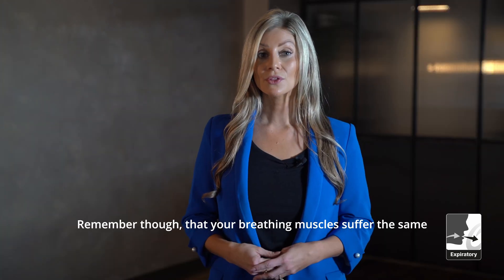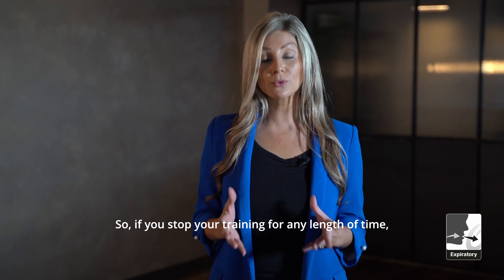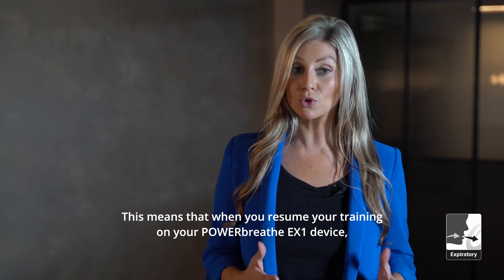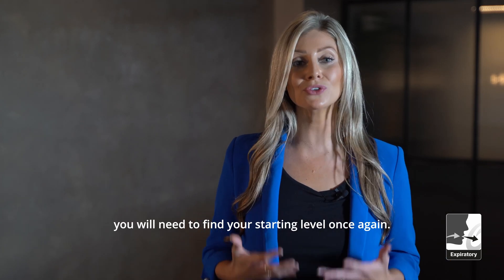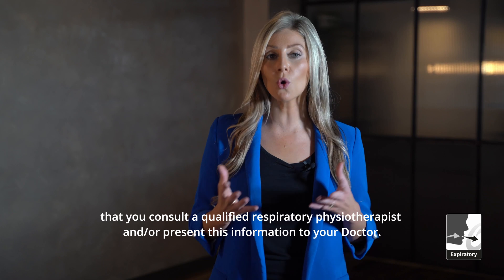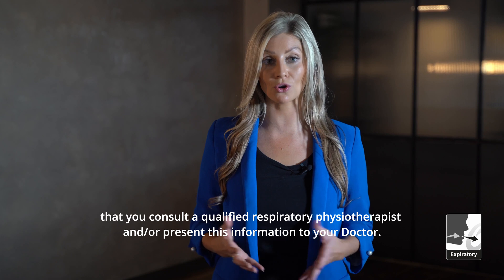Remember though, that breathing muscles suffer the same use-it-or-lose-it effect as your other muscles. So if you stop your training for any length of time, your breathing muscles will begin to lose the strength and stamina that you have built up. This means that when you resume your training on the PowerBreathe EX1 device, you will need to find your starting level once again. We recommend, if using for a particular medical condition, that you consult a qualified respiratory physiotherapist and/or present this information to your doctor.